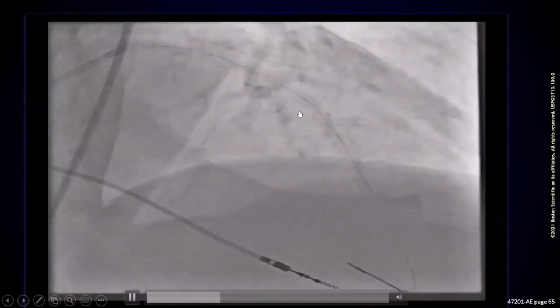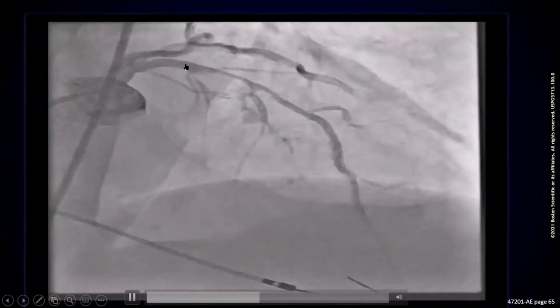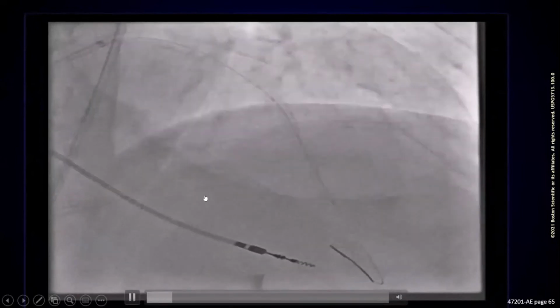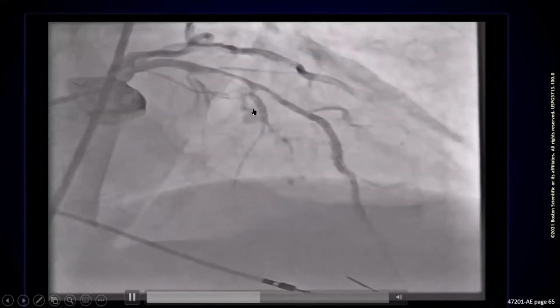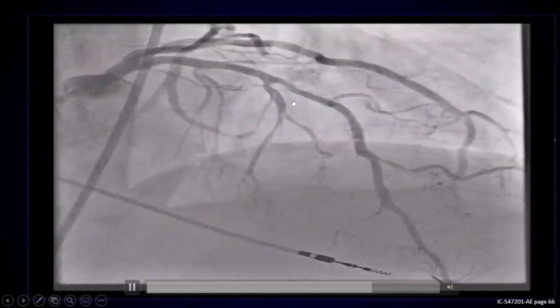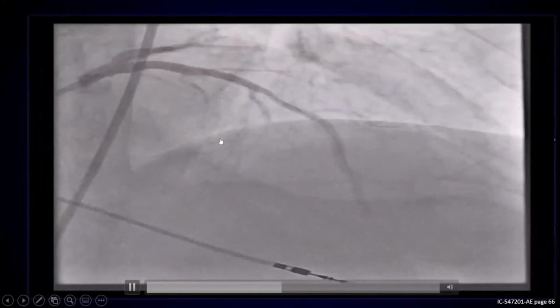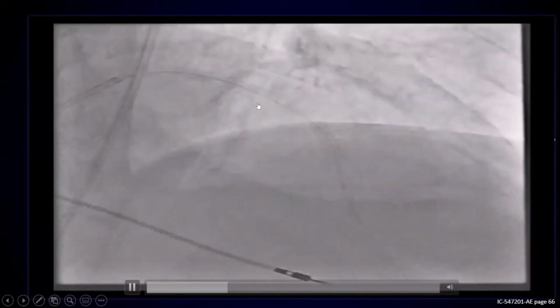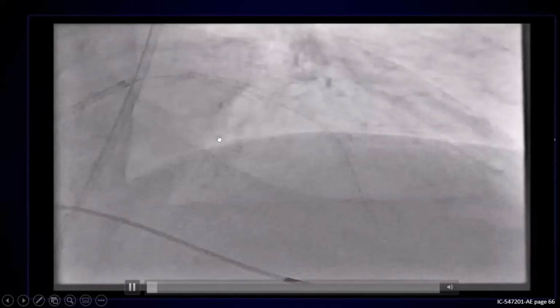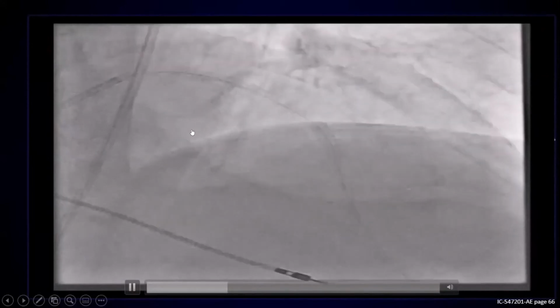And now, would you obviously do a full stent from here to here, or will you have a gap? In fact, this case was done by one of our previous fellows, and he convinced me that we can do IVUS, put a stent proximally and assess the middle segment. So that's what he did. He deliberately left a gap between the two stents to see if we can do some form of spot stenting, not increasing the whole length of the stented segment.